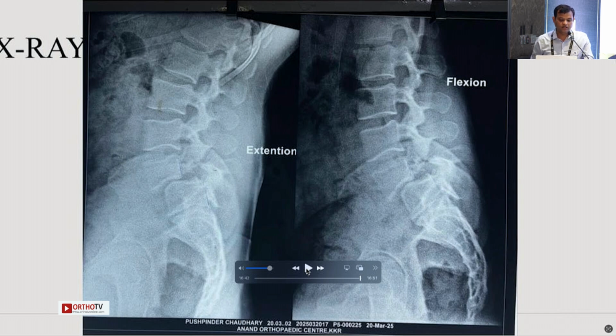The other thing is in difficult cases, in dysplastic pedicles and narrow pedicles, you can plan it very well and the robot executes it very well. Once your team is trained, the anesthesia time might remain the same because the robot setup, draping, the team coming and going out, and planning take time. But as a surgeon, my surgical time reduces by more than half, because each screw just takes 15 to 30 seconds. That reduces quite a bit of time for the surgeon.